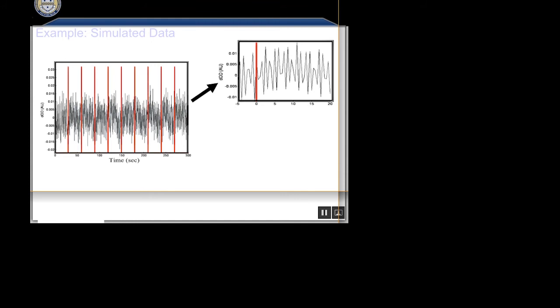You have to actually estimate what that transfer function is. The cardiac signal, the heartbeat measured at my finger, is not the same as a heartbeat measured at my brain. At minimum, there's a time lag between the two. And so what you have to do is put in and try to model that time lag. So you put in lags of the heartbeat signal at the finger and try to estimate that as a filter.